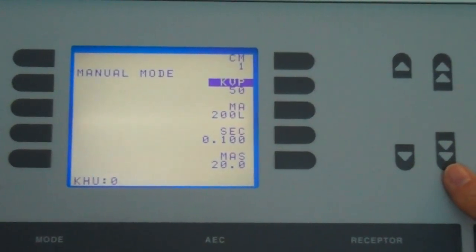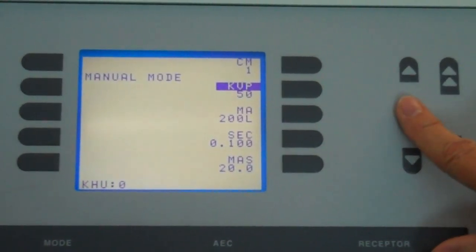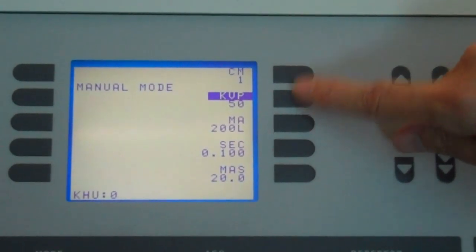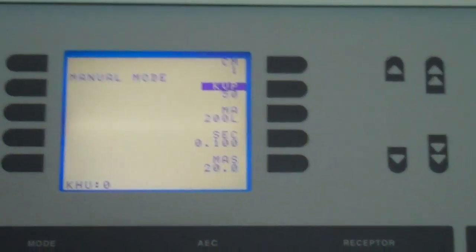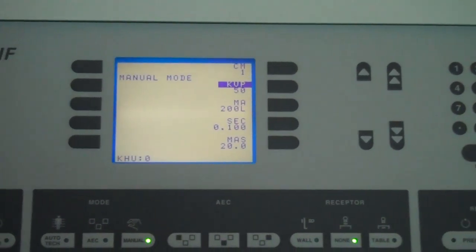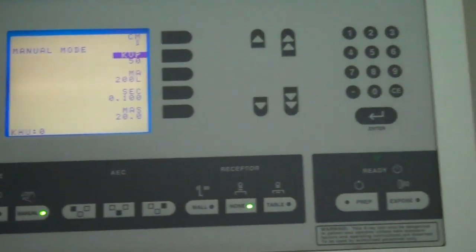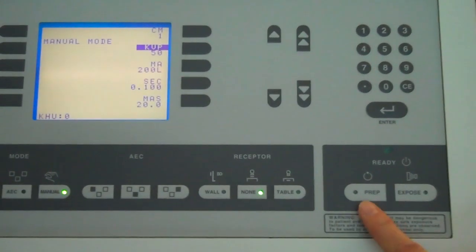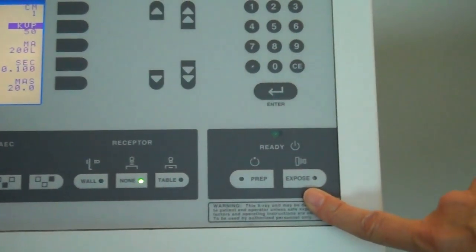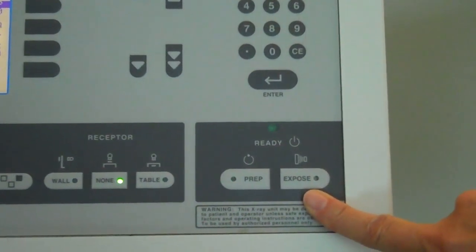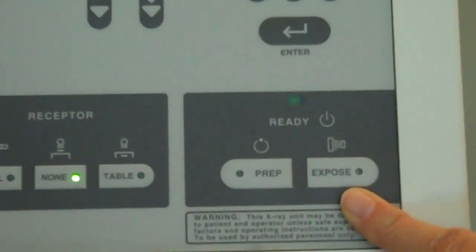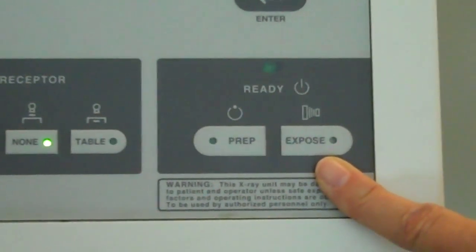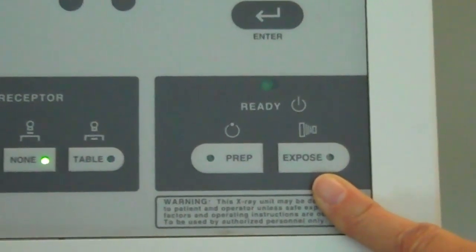And now we have 50. You can use single arrows, double arrows, however you would like to get this to 50. And now we are ready for an exposure on the control panel. Prior to taking this exposure using prep and expose, make sure that you have closed your collimators and removed all image receptors from the room. The door must be closed.